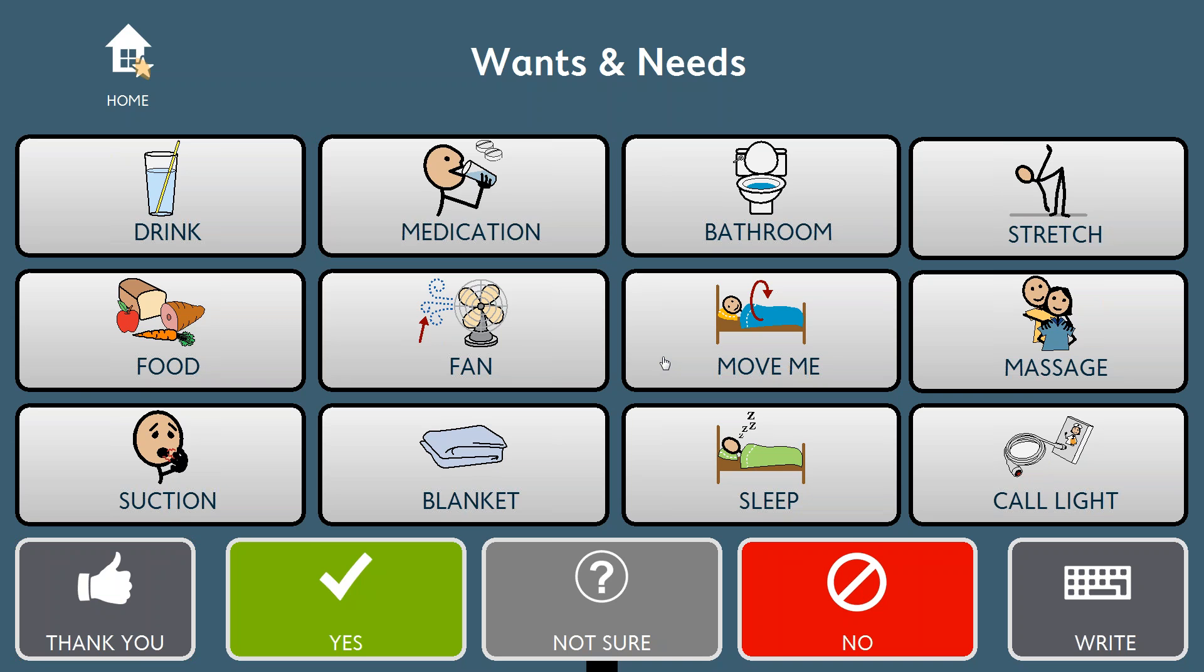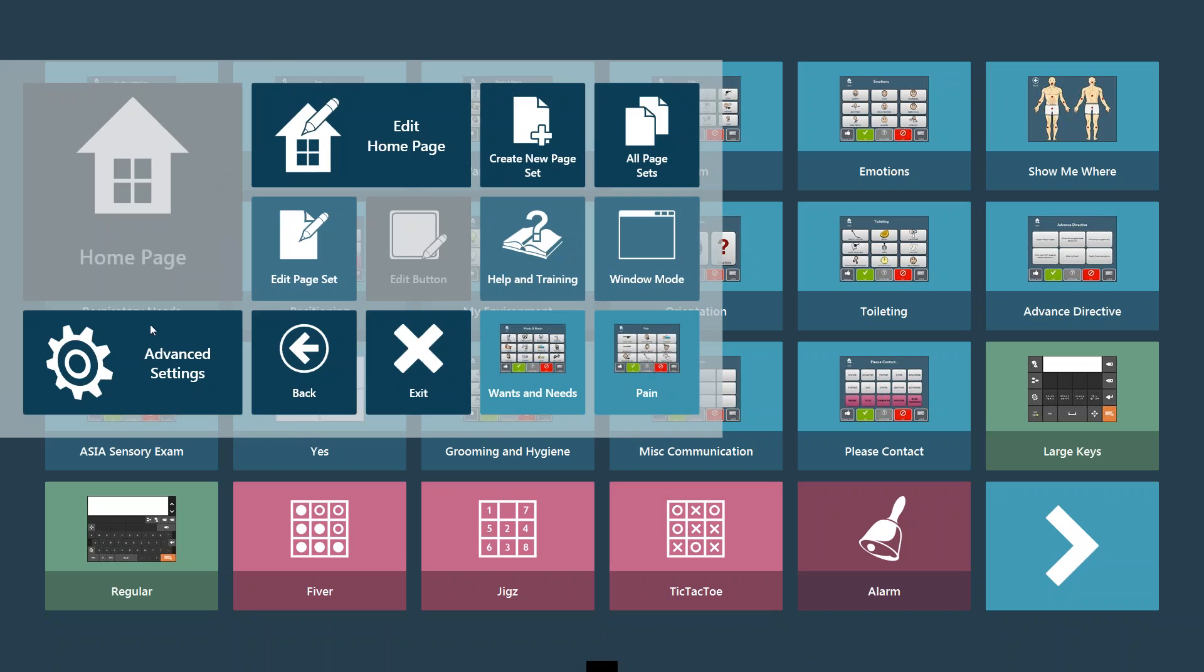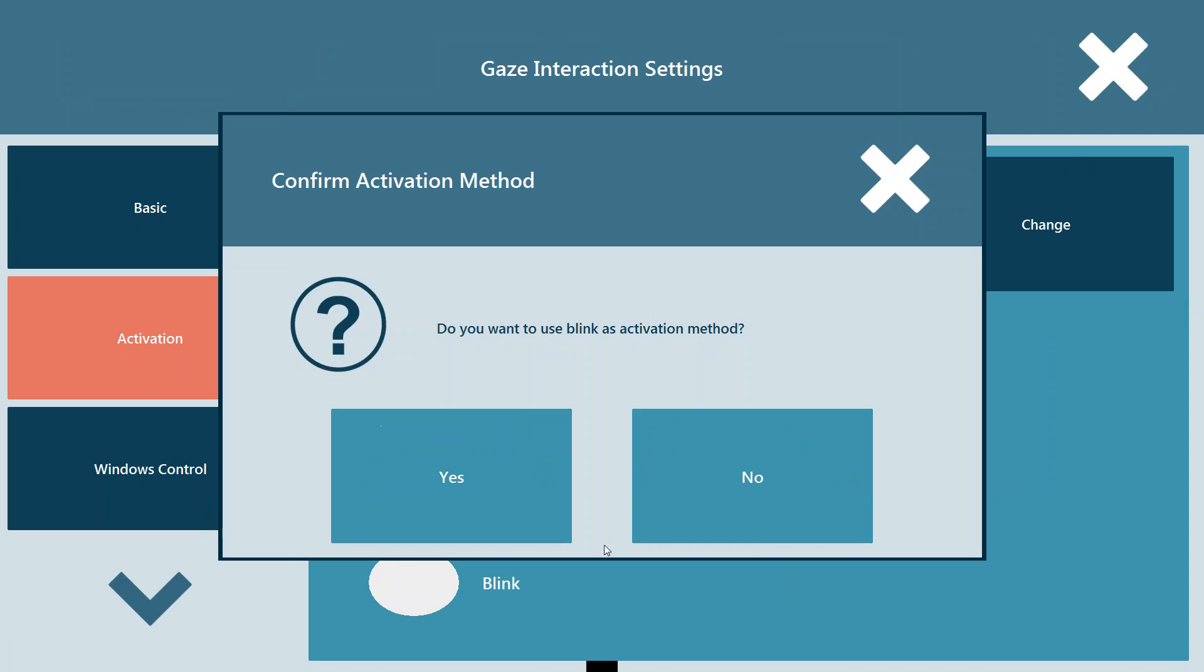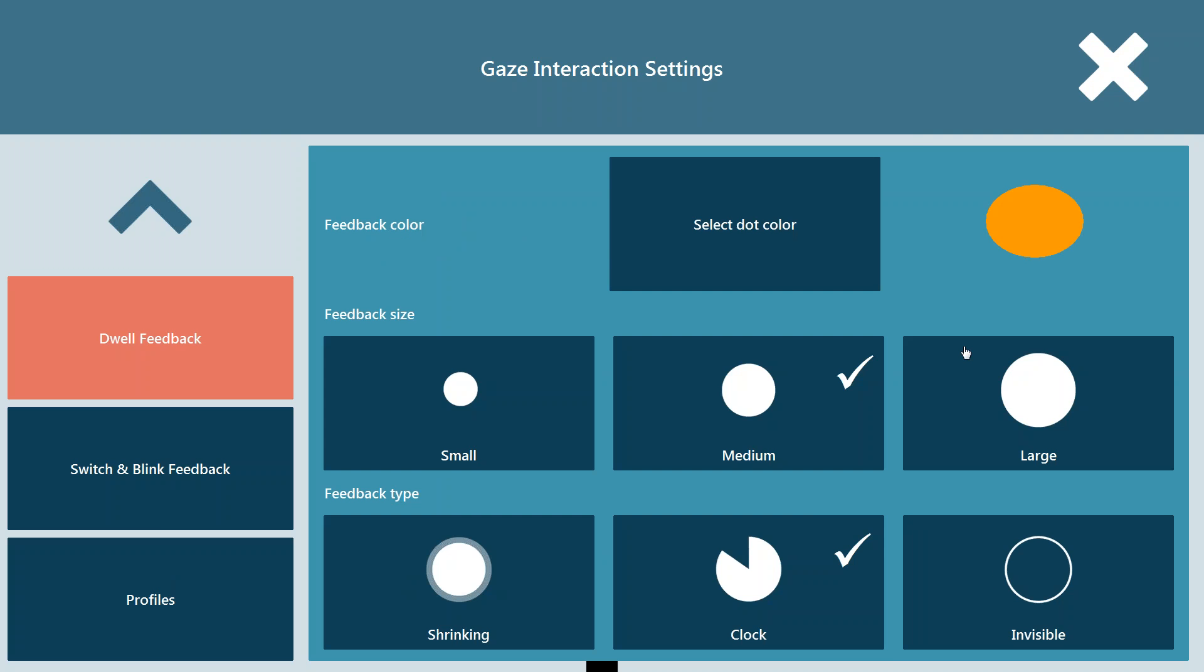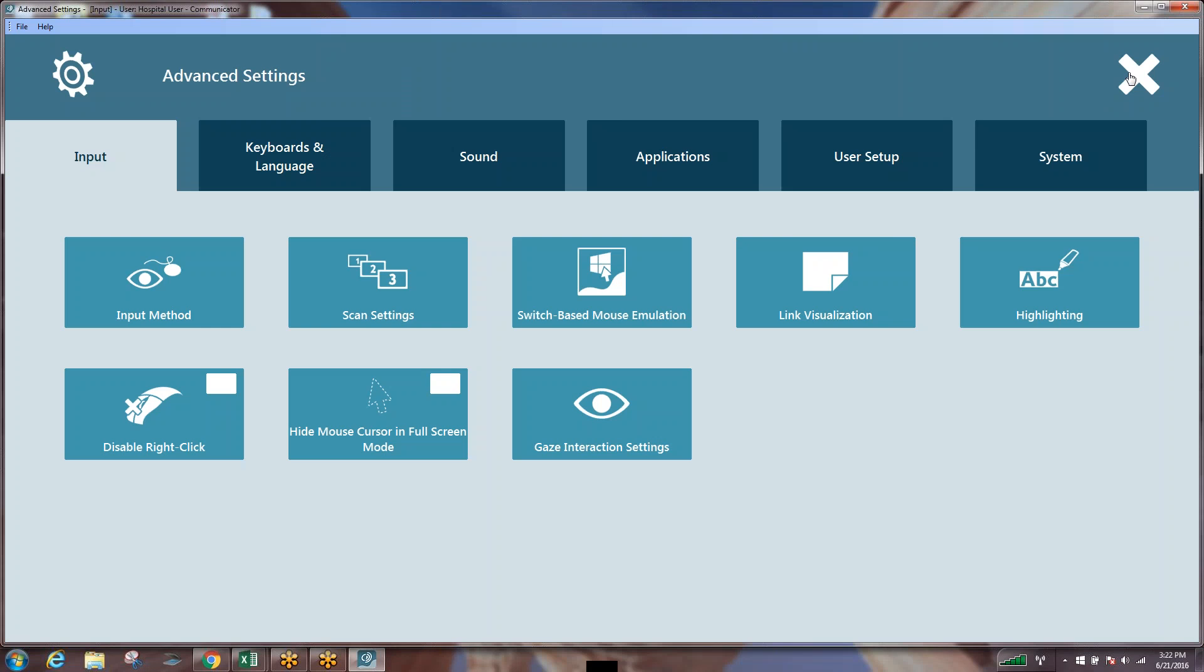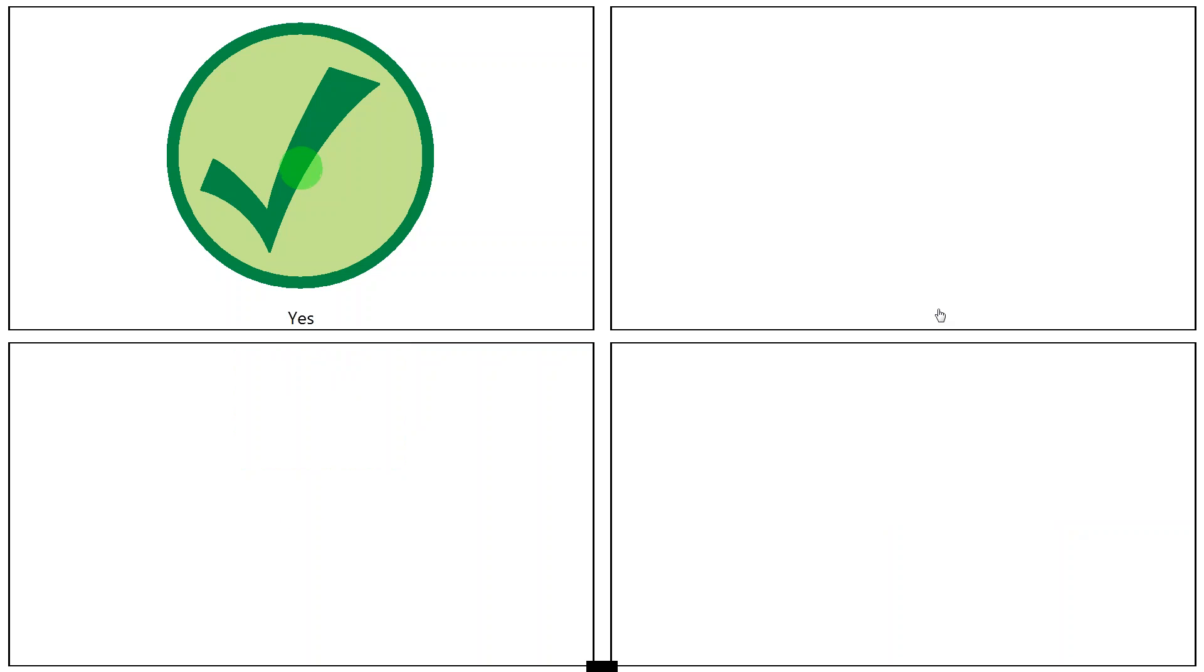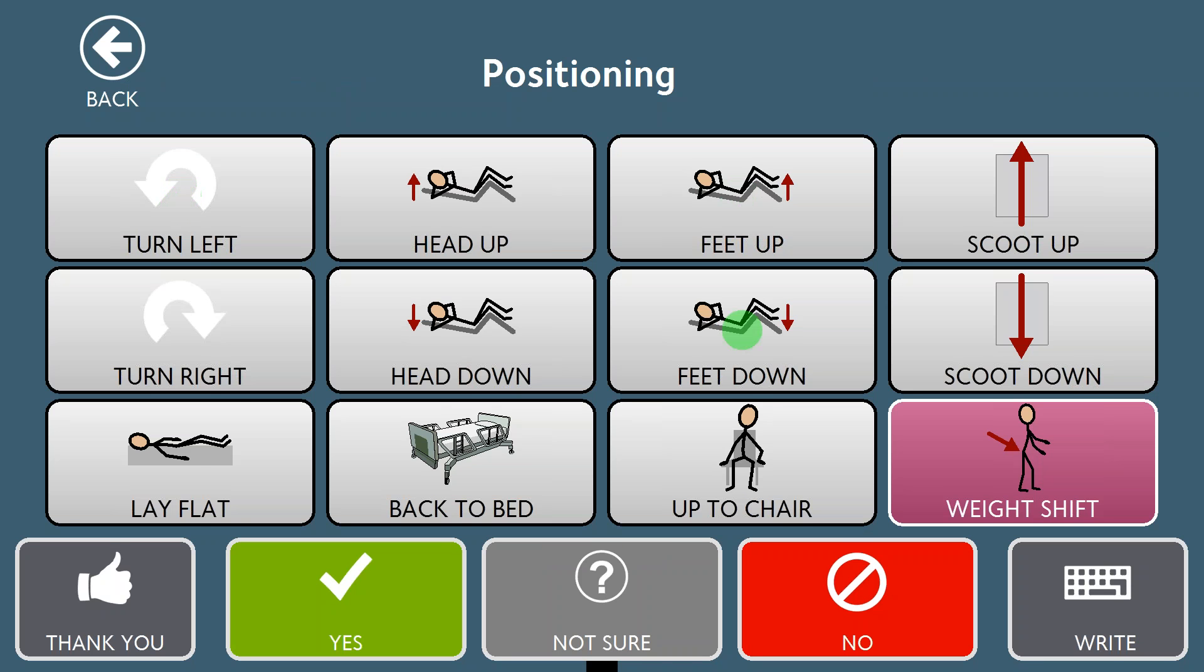Now I'm going to show, I'm going to go back into my settings and I'm going to show you how blink actually works. I'm going to leave this at 200 and 1000, and I'm actually going to change my feedback type as well because that looked a little bit difficult. It was a little bit harder for me to see. So now I'm on blink. As I look at my buttons, you'll see I'm not making a selection. Right now I'm purposefully not blinking. Or if I am blinking, I'm trying to blink rather quickly. And I actually made that selection in error. So what I want to do is play with this time so that I'm comfortable that I can look around on the screen. And then when I'm ready to select positioning, I can make a blink. Please turn me onto my back. Lay flat. Please turn me to the left.